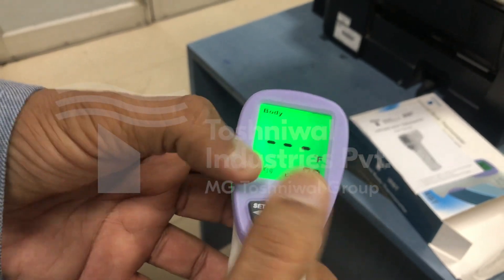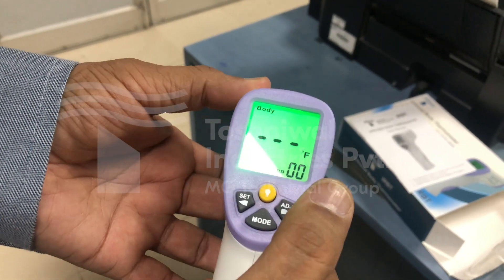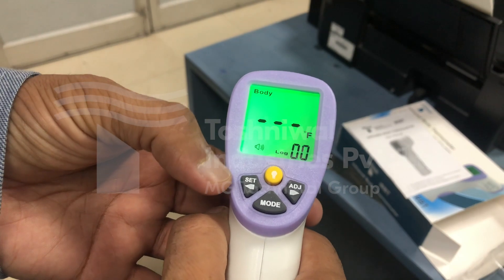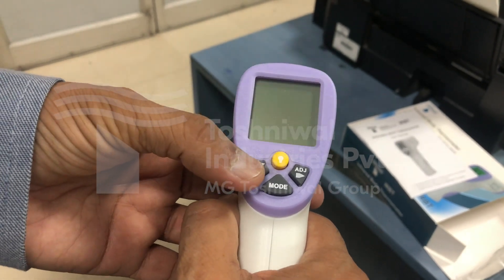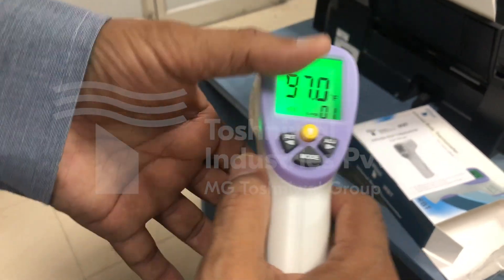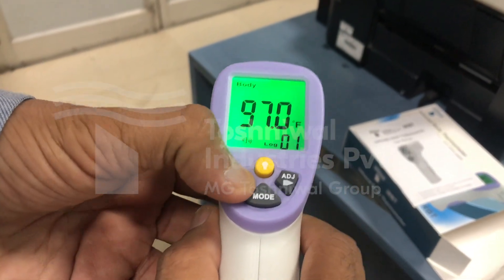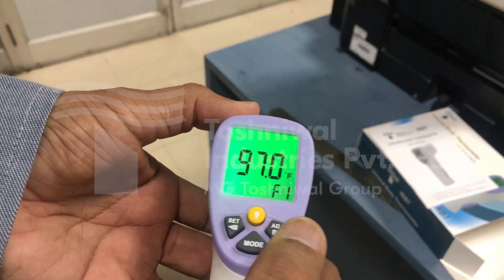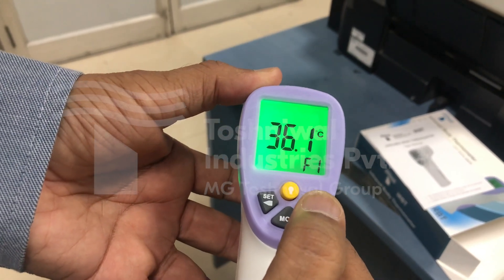We'll reset all the logs to zero. I've already selected degree Fahrenheit. If I want to change to degree centigrade, on pressing this the display gets on, and pressing this for two seconds I get F1, and I can change from degree centigrade to degree Fahrenheit.